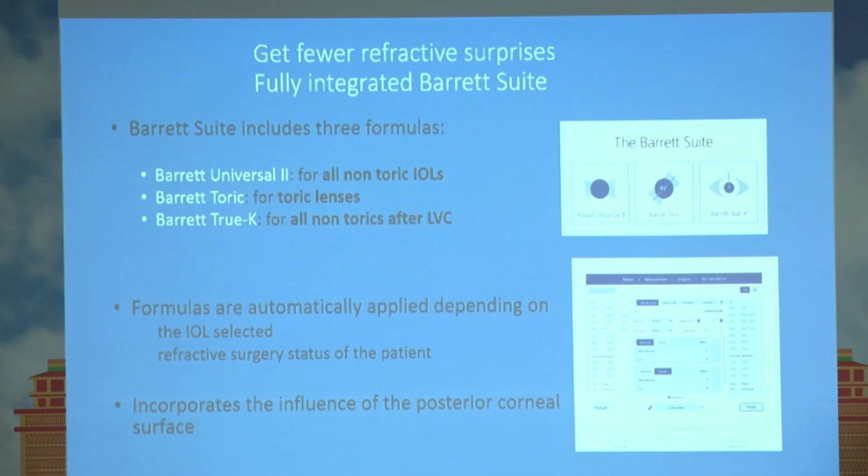So now the thing is, most patients come post-refractive surgery. This has a fully integrated Barrett Suite, so with that you can get into all the formulas and the results are going to be very, very accurate.